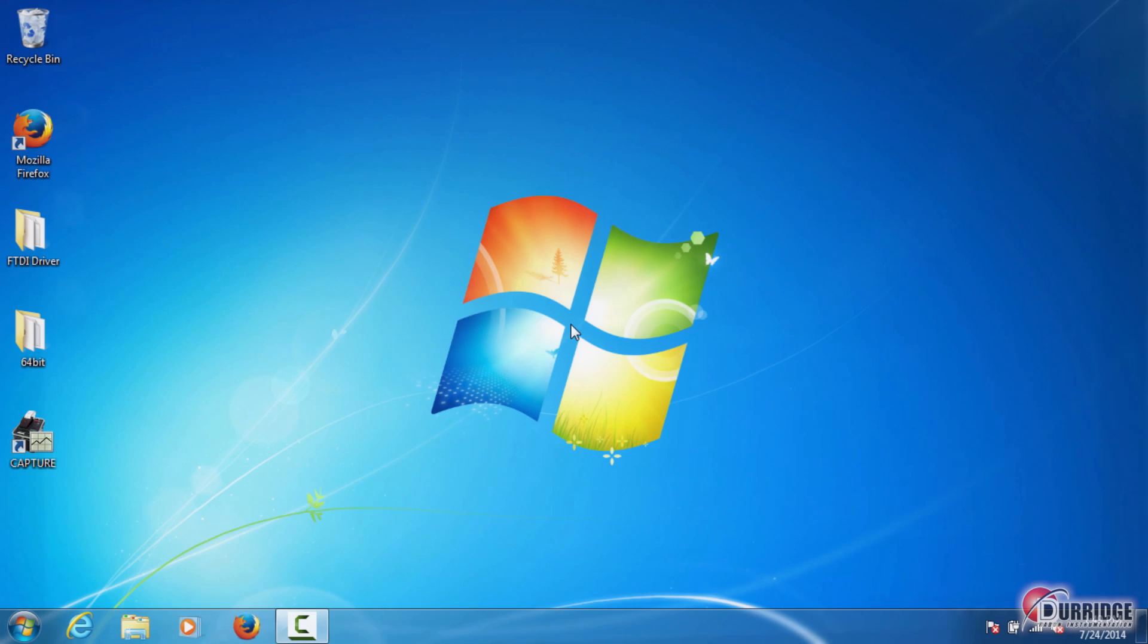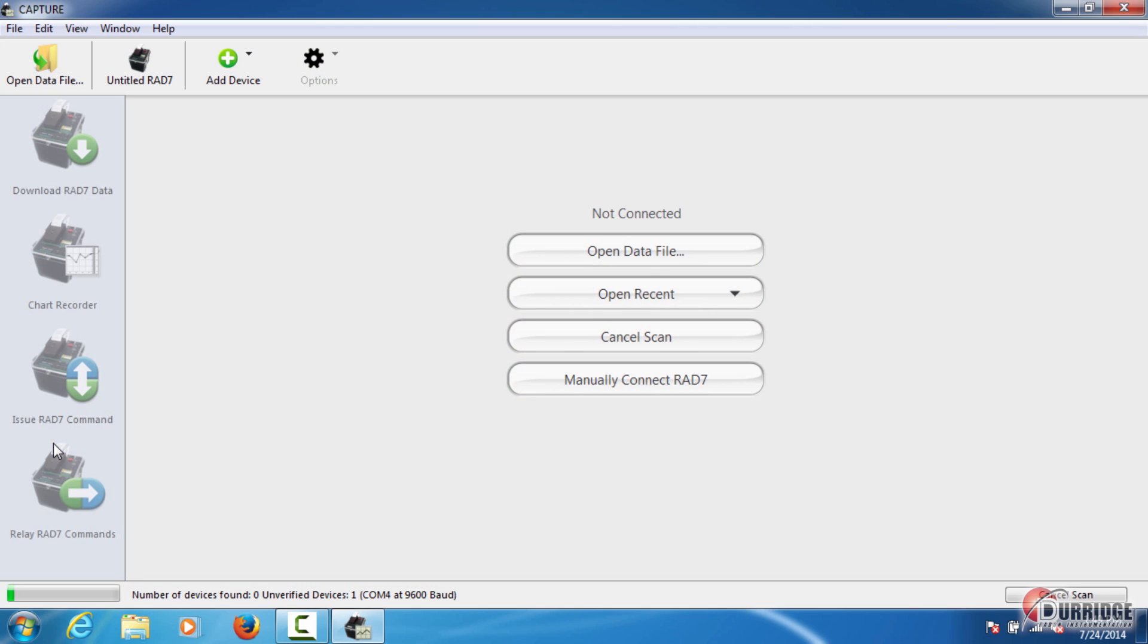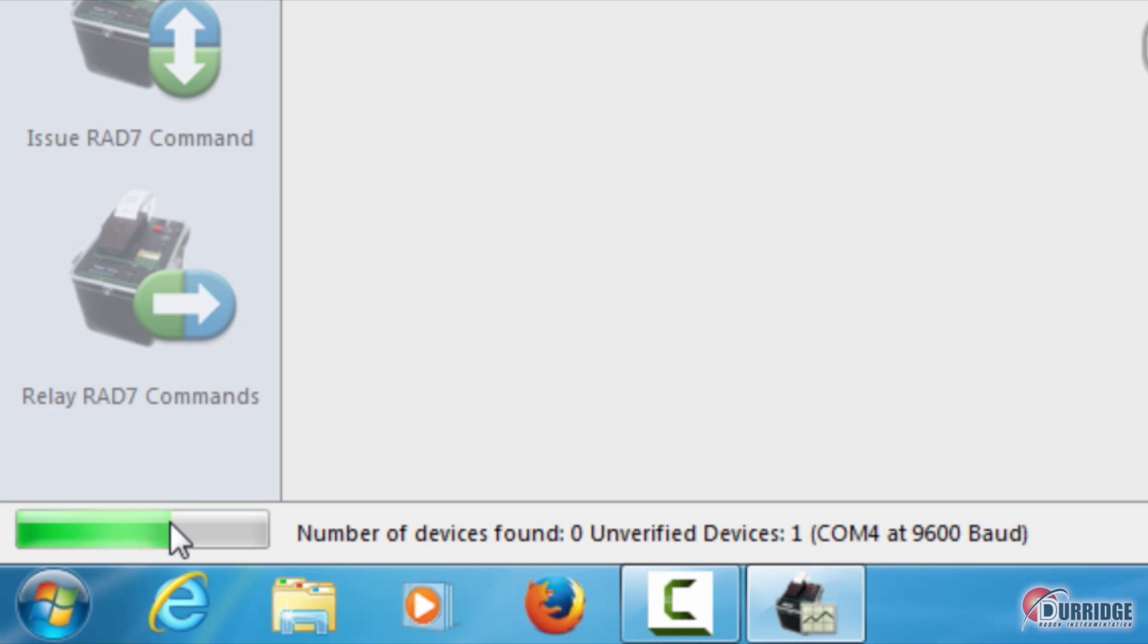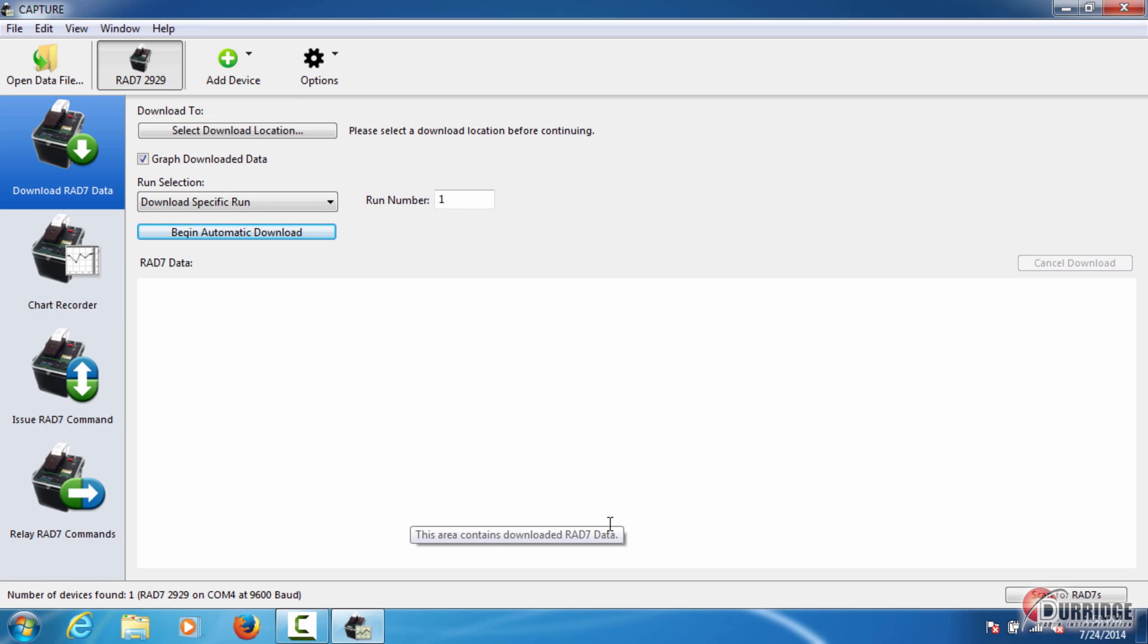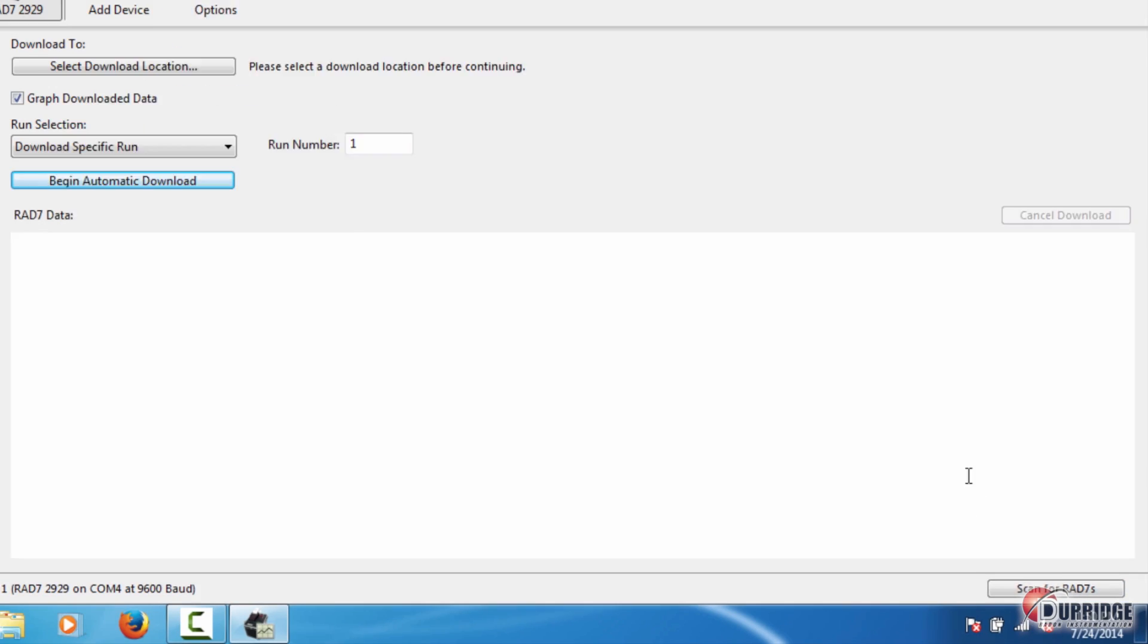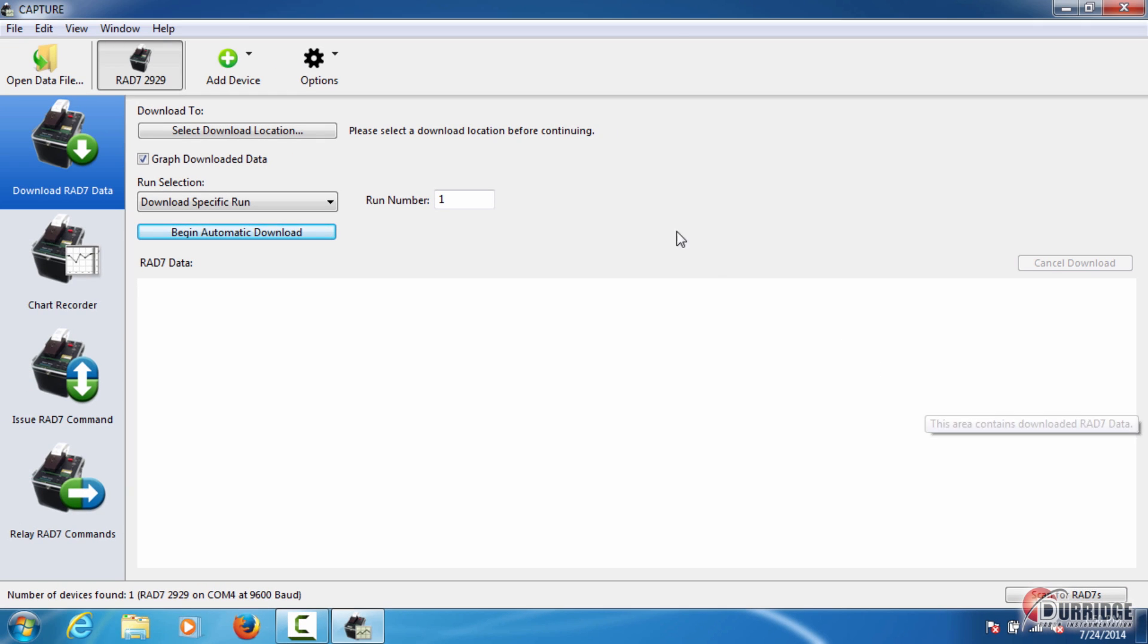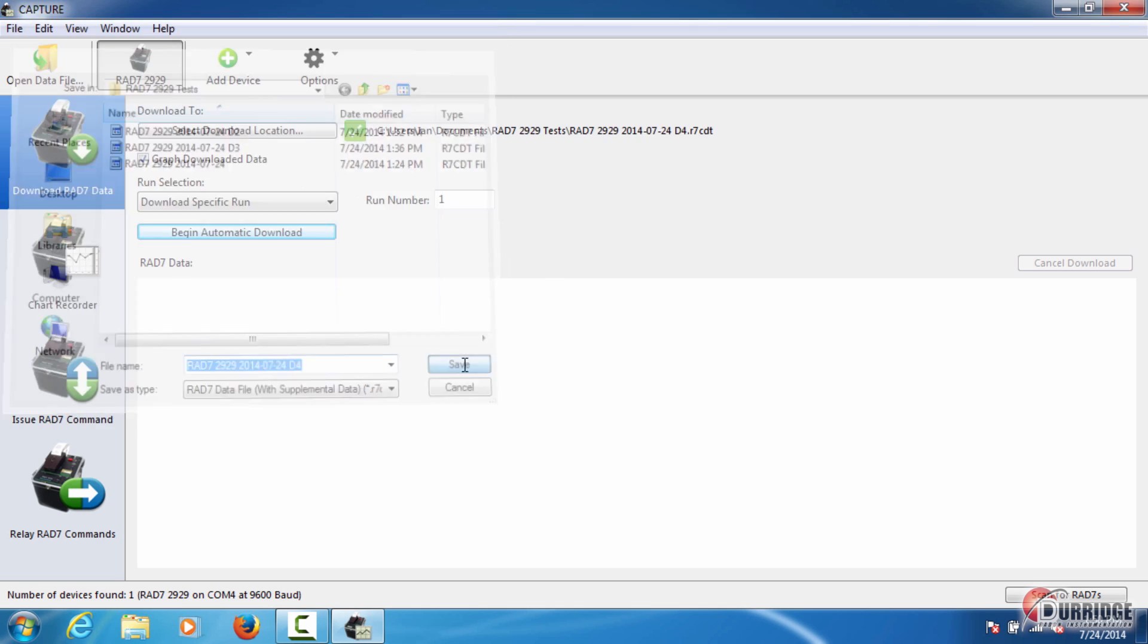Once the RAD7 is connected to your computer, you can download its data through Capture. If it isn't already open, open Capture on your computer by double-clicking the shortcut on the desktop. The program should complete an automatic scan for devices and connect to your RAD7. To start the scan manually, you can click the button Scan for RAD7s on the bottom right of the screen. Once connected, Capture prepares to download the data. Choose where you want to save the data on your computer by clicking Select Download Location and entering the desired name here. You can change the file name or save it according to the default timestamp. Click Save.